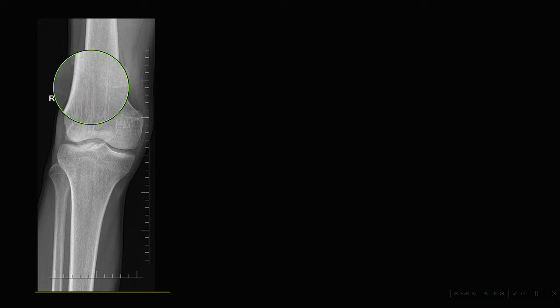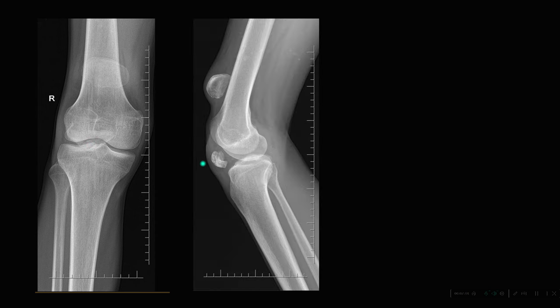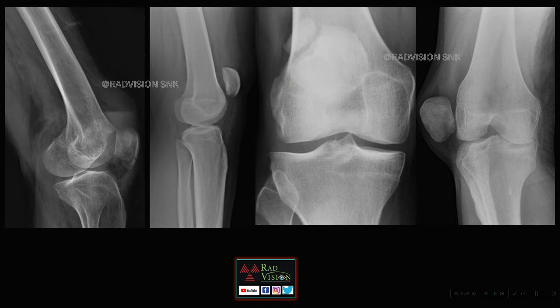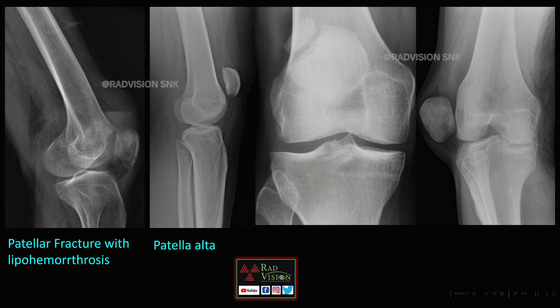Next, patellar cases: a high-riding patella (patella alta) with a bony lesion projected over the knee joint in lateral view, along with a fragment in the infrapatellar Hoffa's fat pad, represents an old patellar fracture. Other patellar cases include patellar fracture with lipohemarthrosis showing fat-fluid levels, patella alta, bipartite patella with an unfused superior pole, and patellar dislocation.